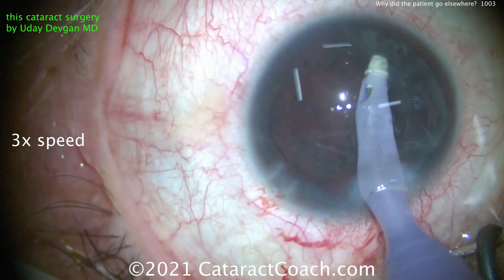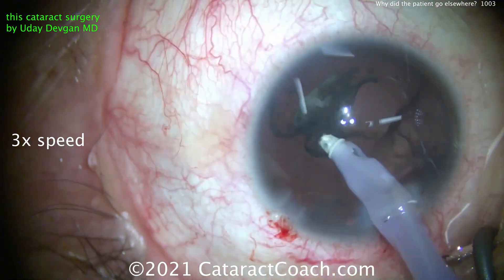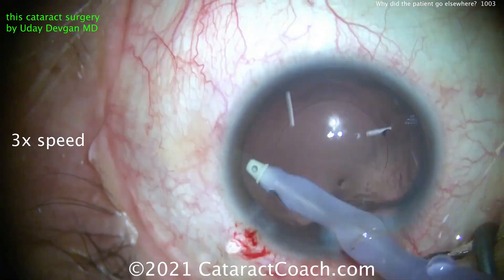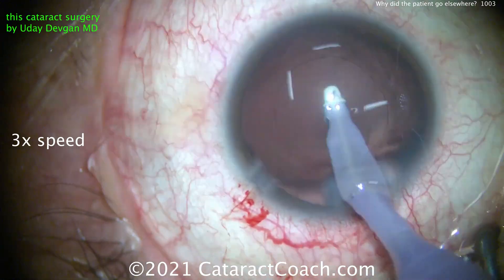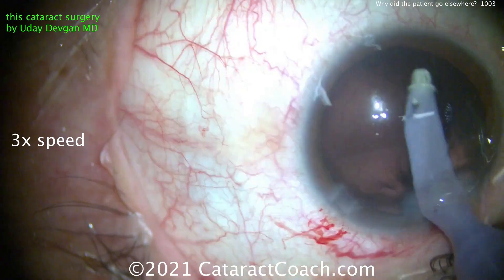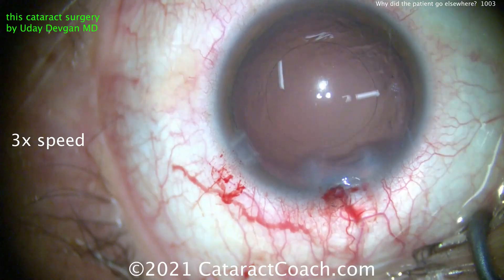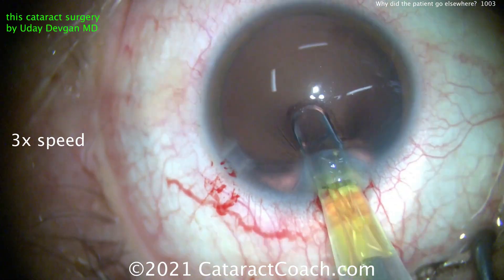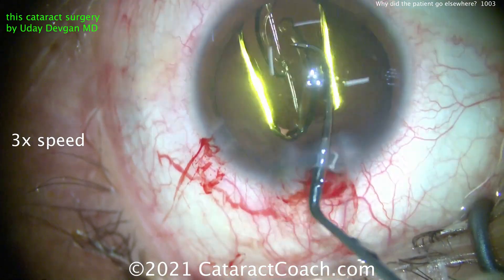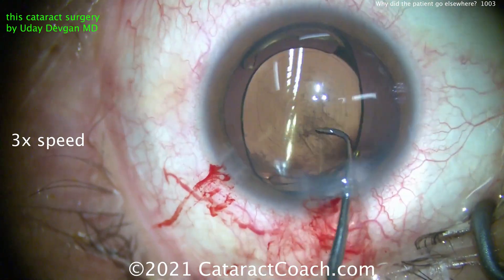The nucleus was soft and we removed it very quickly. Here comes the cortex removal — that goes beautifully as well. The whole cataract case was totally routine and we really sweated the lens calculations to get this patient the exact outcome that was promised: a plano outcome. There's cleaning up the capsule bag, the viscoelastic going in, beautiful rhexis as we see, and here comes the IOL going into the capsule bag. We'll put this into position and perfectly center the lens.